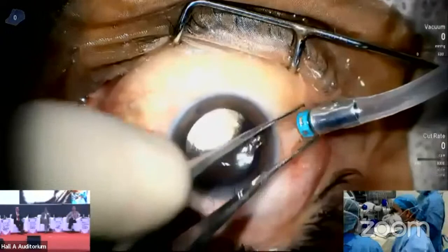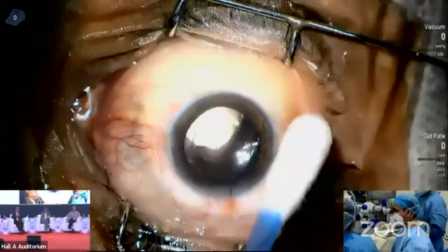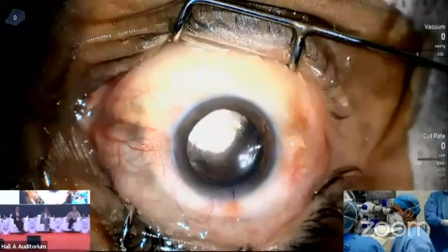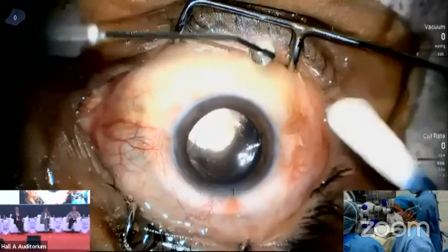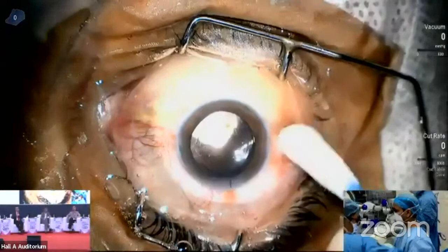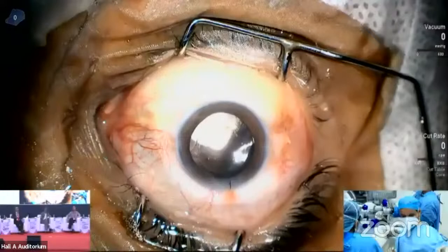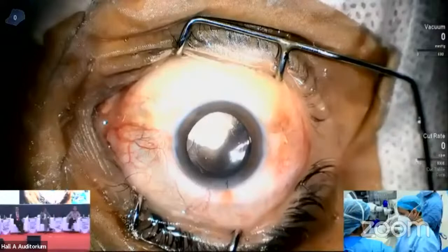So how do you want to leave the globe at the end? Normally I leave it a little normotensive, neither hypertensive nor hypotensive. If you put a suture, there is always some bit of irritation, and the patient will complain in the post-operative period. But if you do not put a suture, just maintain a little patience and massage them well, you can see the eye looks absolutely quiet. The patient has undergone phacoemulsification as well as vitrectomy. The eye is absolutely quiet, and the patients are very comfortable in the post-operative period. Okay, so we'll end the surgery with the subconjunctival injection.